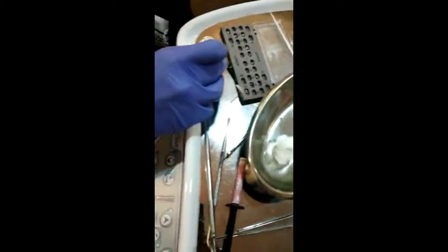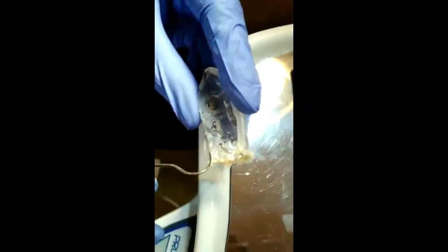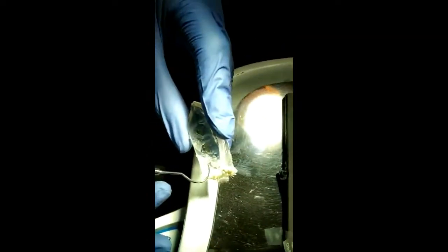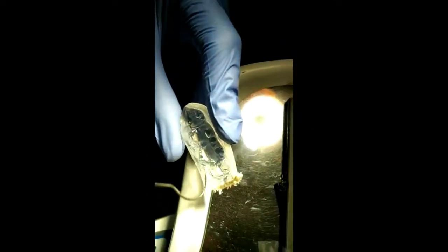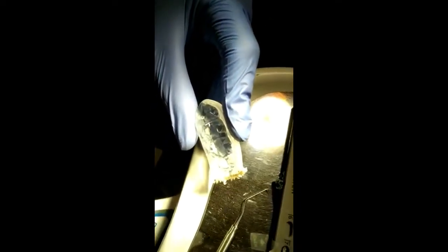Here, as we can see, we have our indirect bonding tray with the brackets in place. The bonding tray has already been sectioned, and over here we have the section of the tray which shall go and fit in the second quadrant. The first premolar has been excluded from the arch. The second premolar, first molar and second molar are present.